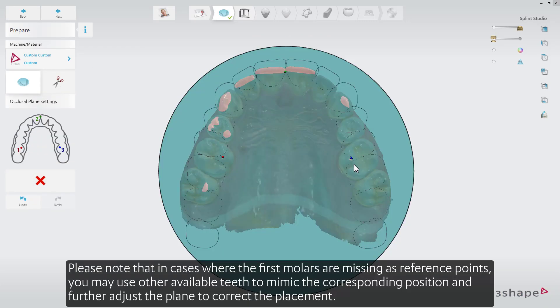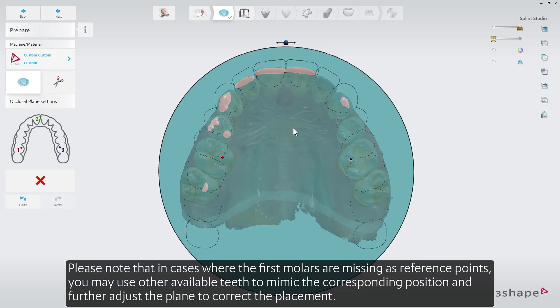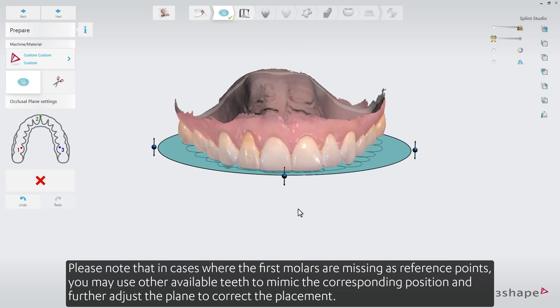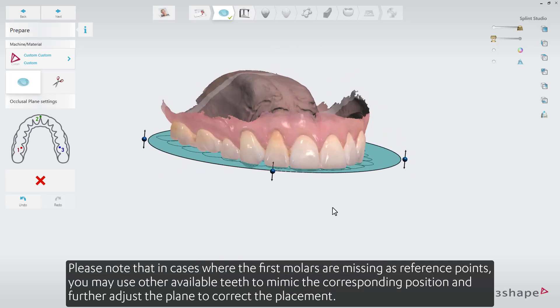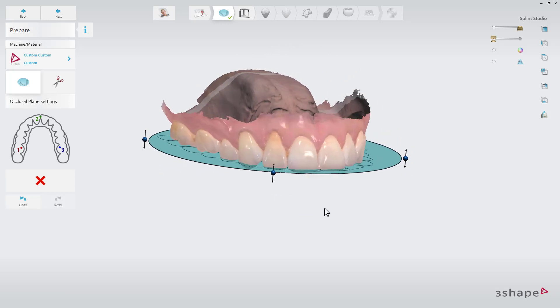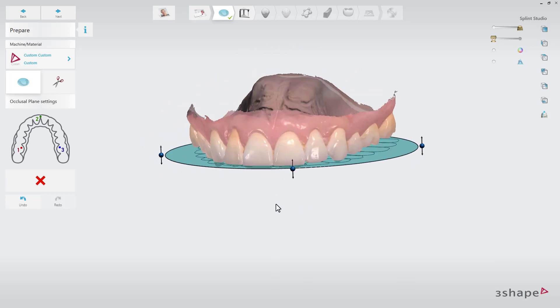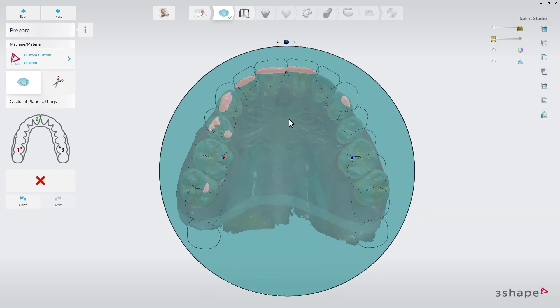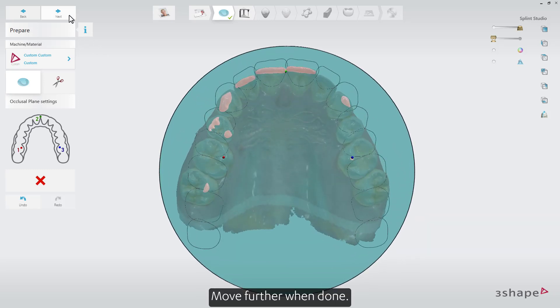Please note that in cases where the first molars are missing as reference points, you may use other available teeth to mimic the corresponding position, and further adjust the plane to correct the placement. Move further when done.